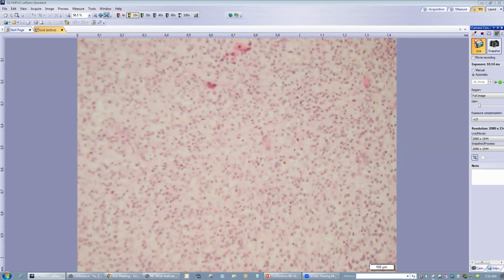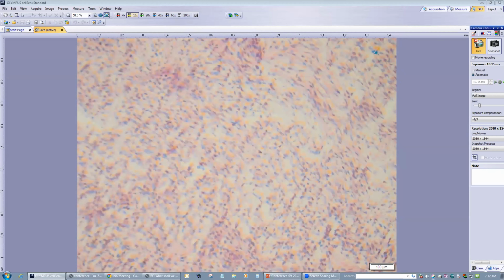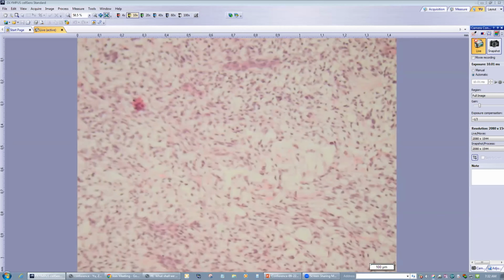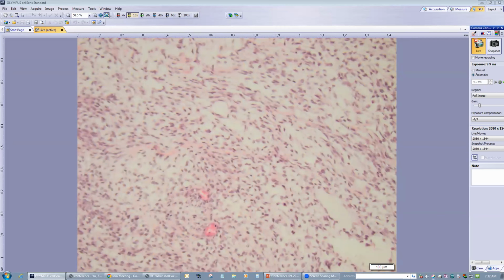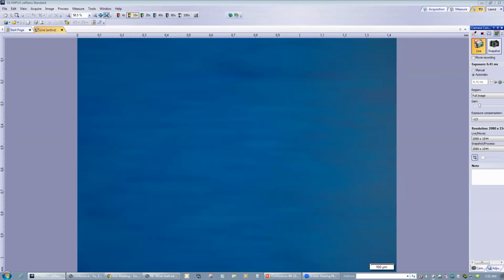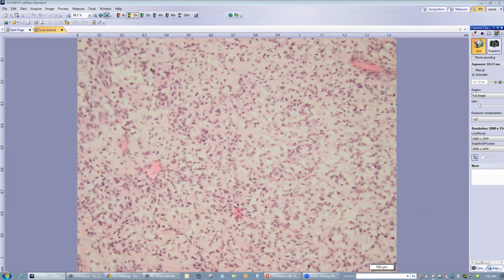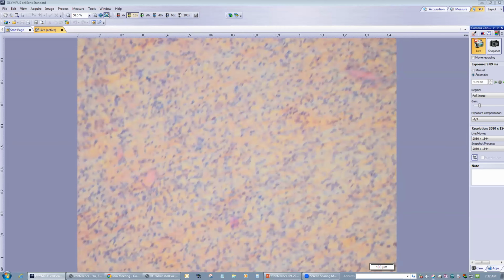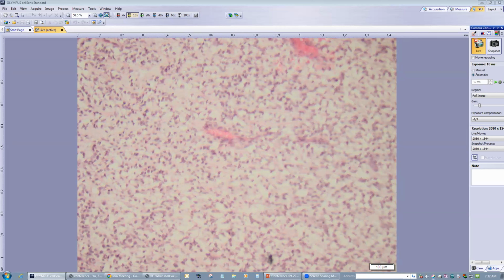Looking, this clearing you usually see in probably 30 to 40% of tumors. The cells do not look like the adult type of clear cell renal cell carcinoma, but this entity is clear cell sarcoma of kidney.